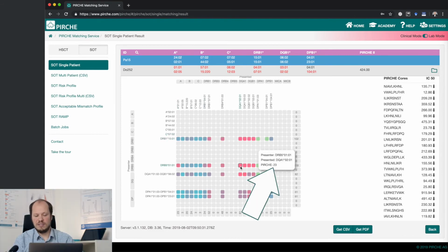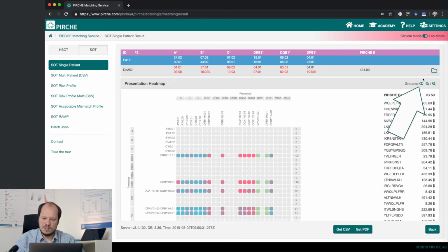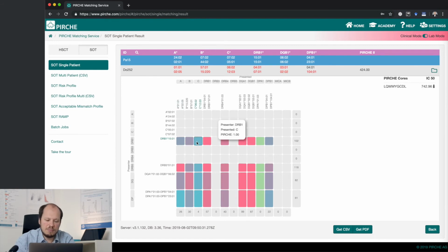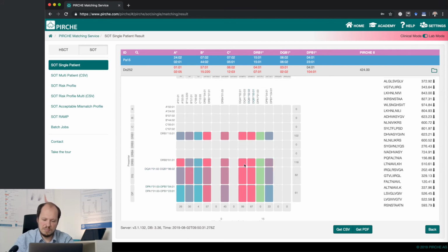And you can see we have here 23 peptides, and these are also highlighted and listed here on the right hand side of that graph. Let's switch back to the locus view, and you can see again the DR locus here is rather low in expression of the ABC derived peptides. The DQA and DQB apparently is rather strong in being presented on all loci actually.